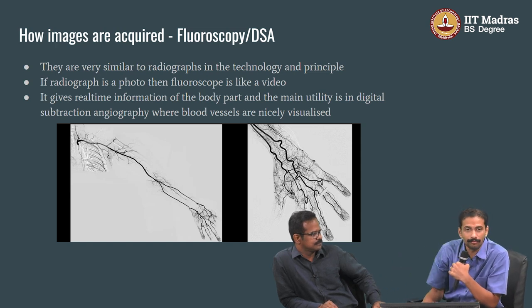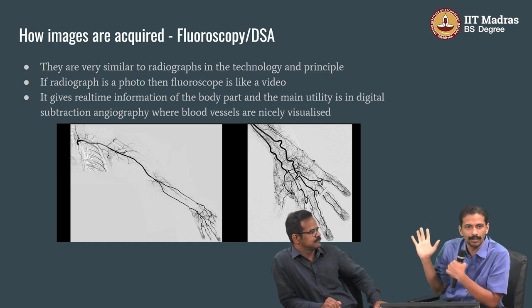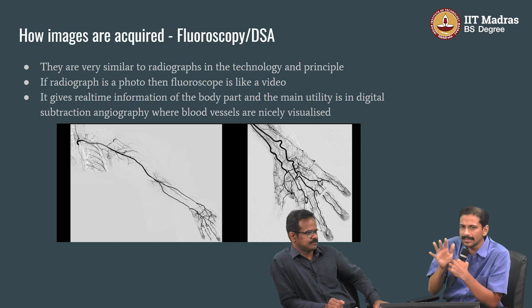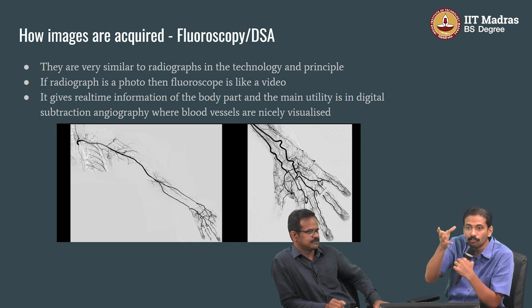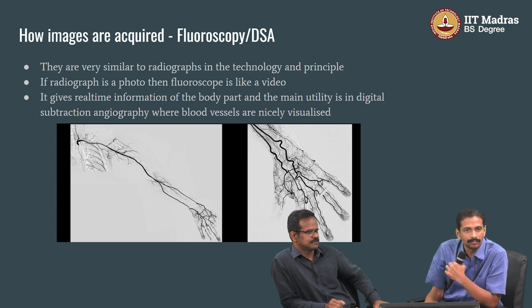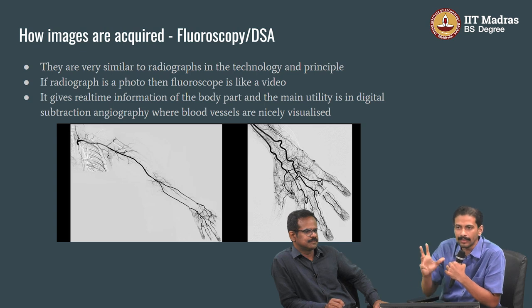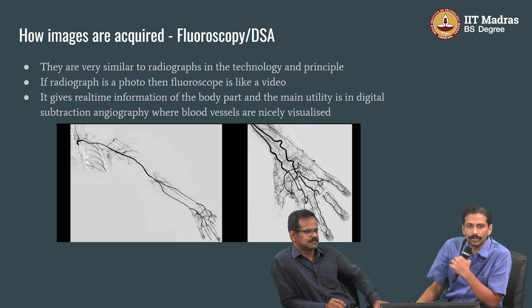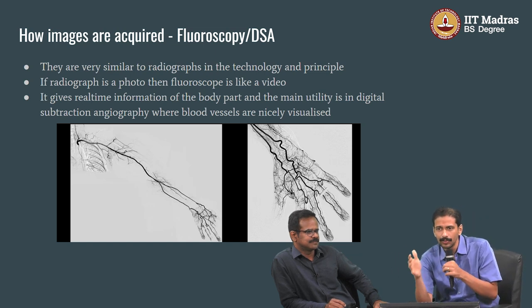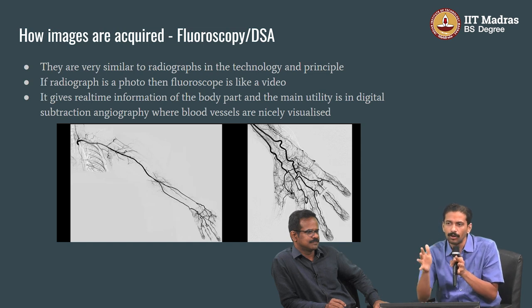Why is there a need for a video? If there is a photograph, why is there a need for a video? There are certain situations where you need to study movements, which won't be clear on snapshot modalities. Photos will not show you great information on what you're looking for. So fluoroscopy is like an X-ray video, which collects the same information over a period of time.